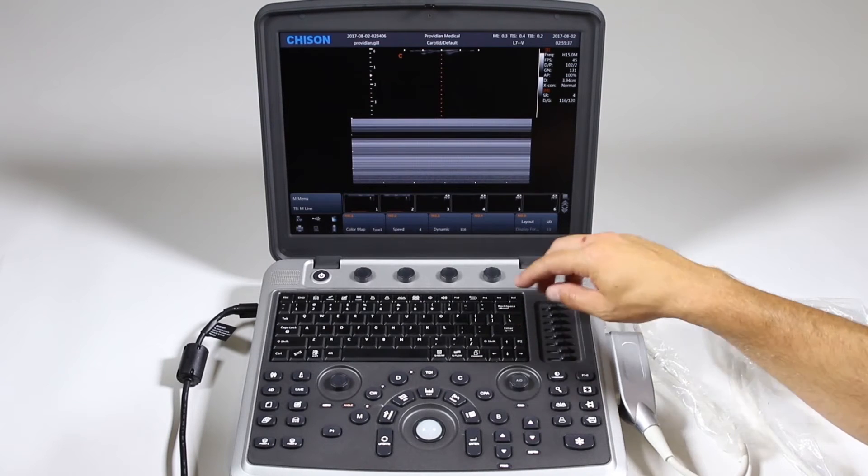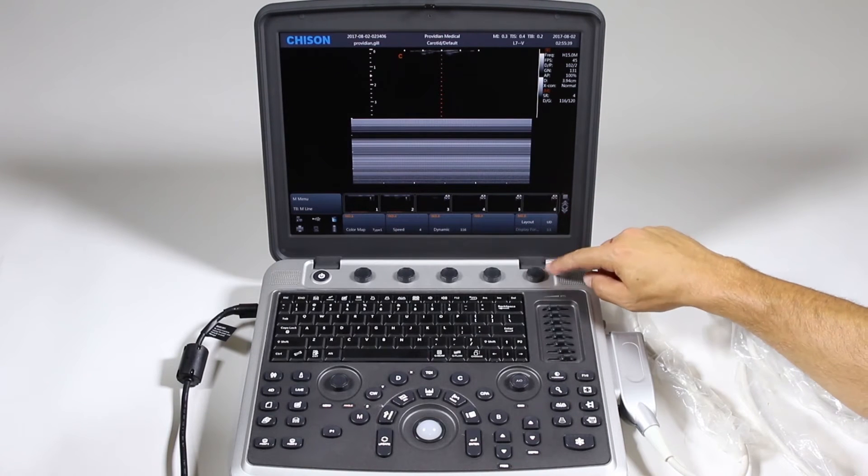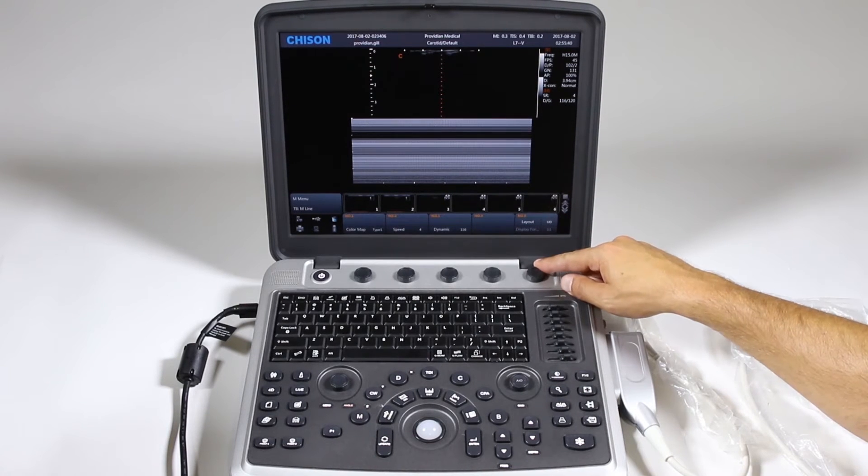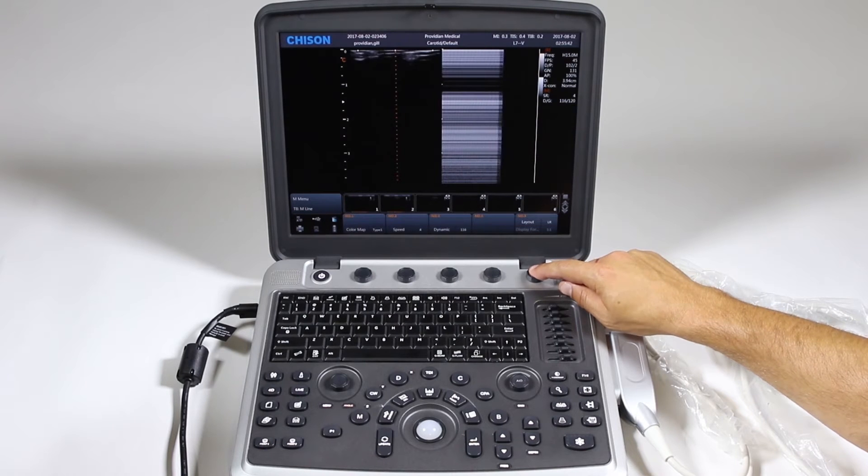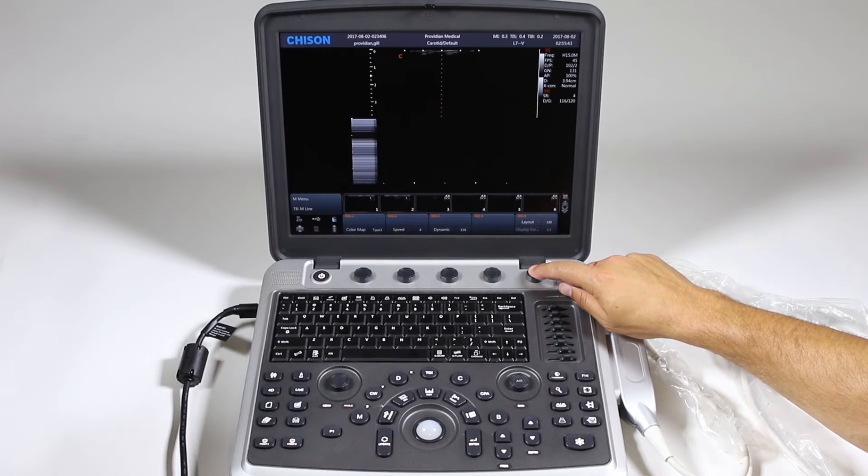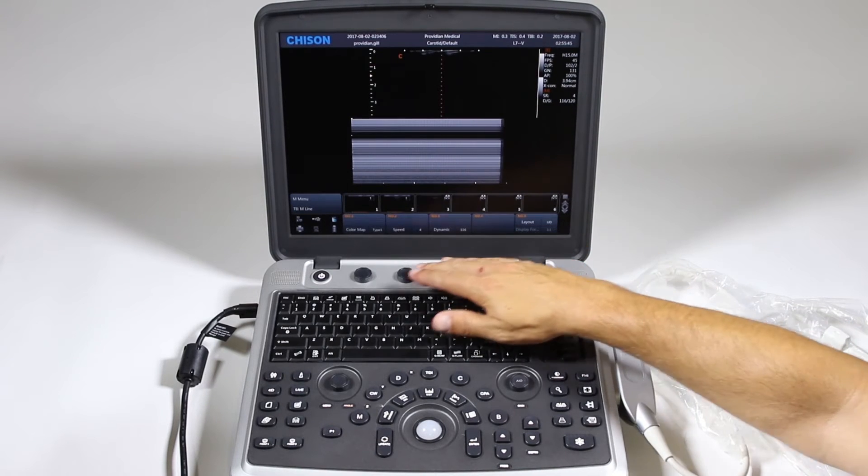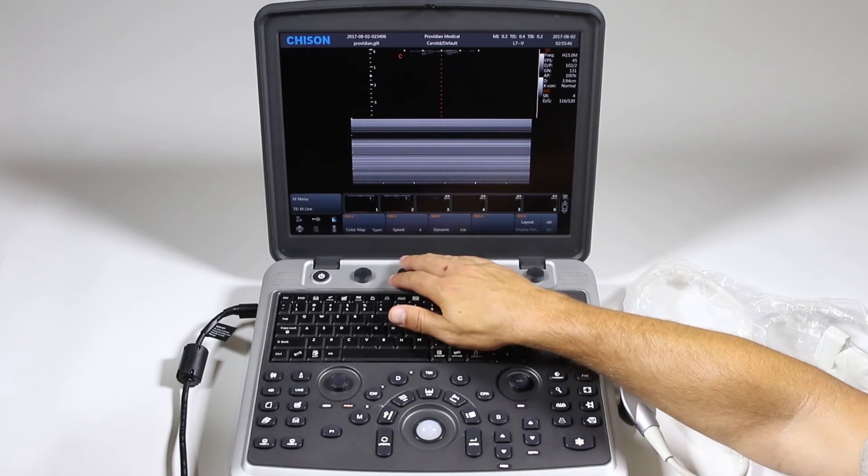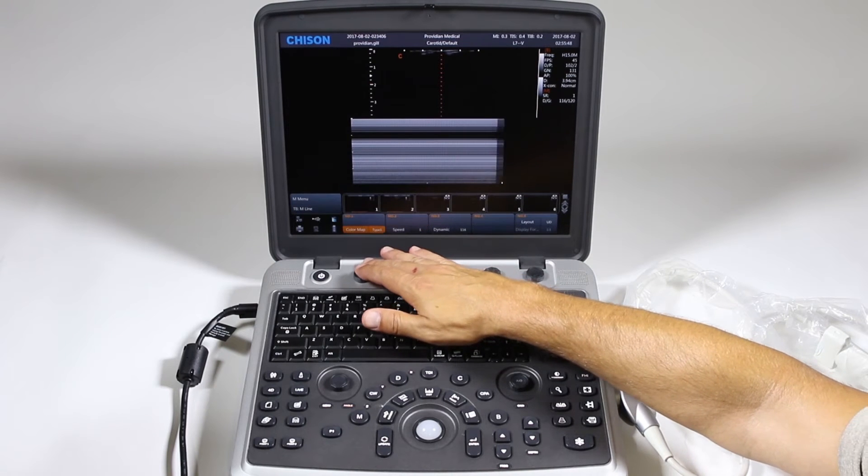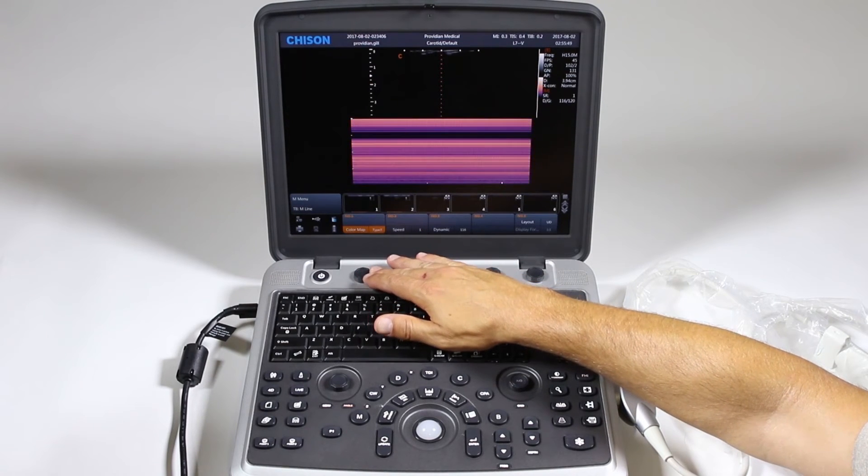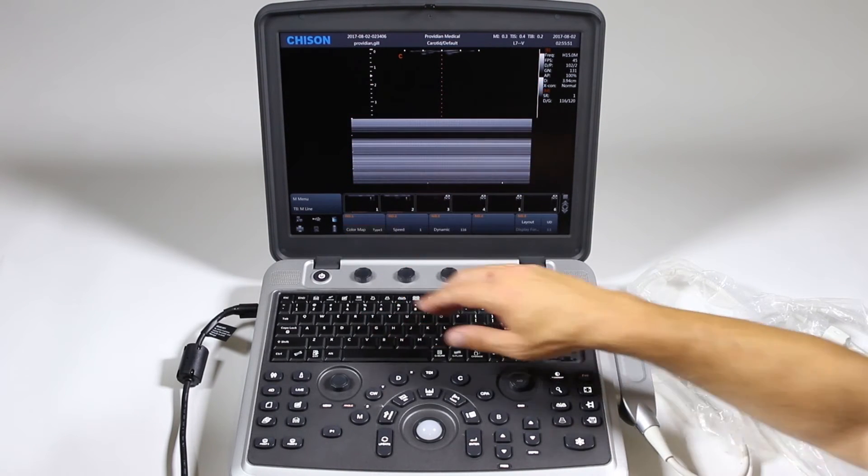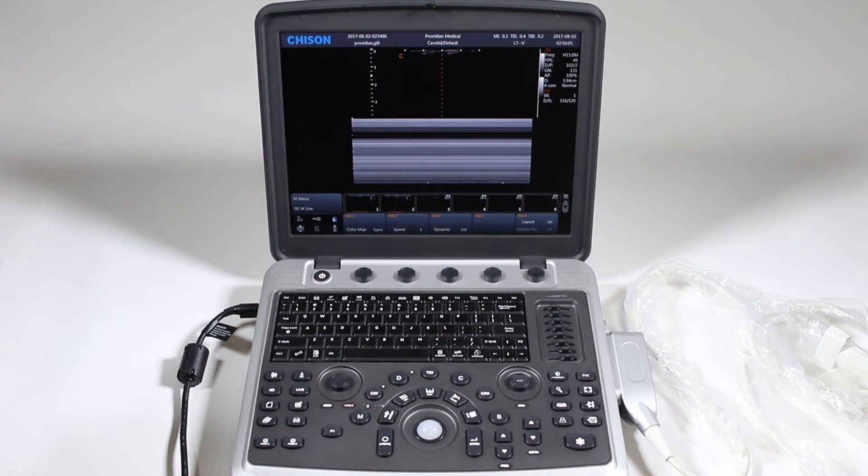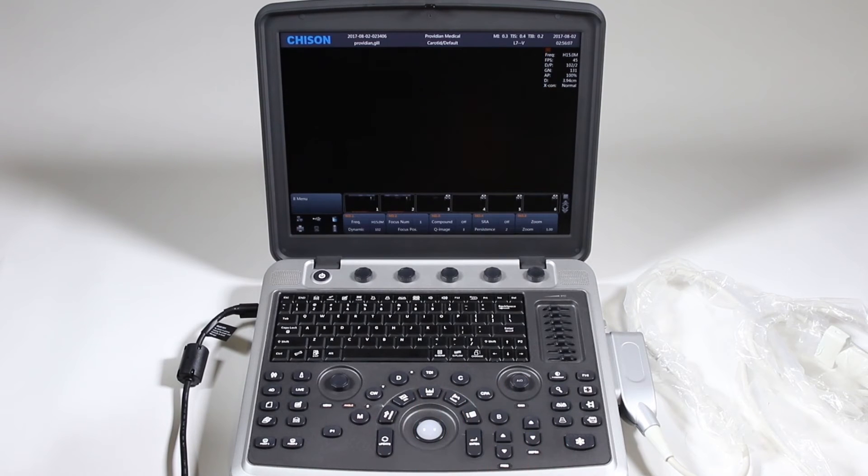Now this is a little different than your dual. To change the layout you can just simply push and it'll go left right or up and down. Change the dynamic range, the sweep speed, and your color maps are all right here. To get out of that just simply click B and you're back in B mode.